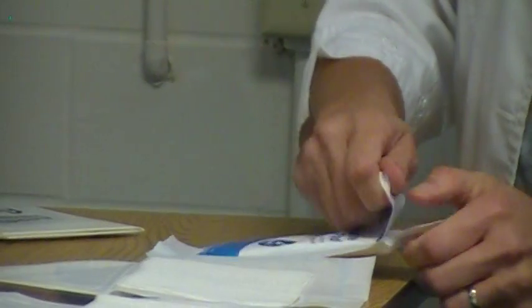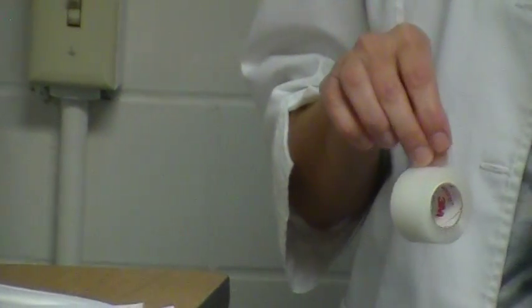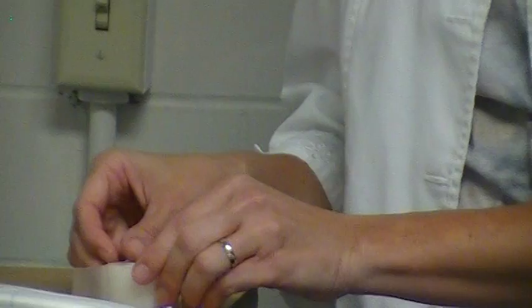My ABD pad's going to be the last thing that I put on, so I'm going to go ahead and have it last. I'm going to go ahead and just have my tape ready to go. I can't stick it on here because that's not good standard precautions. Just have it ready to go like that.